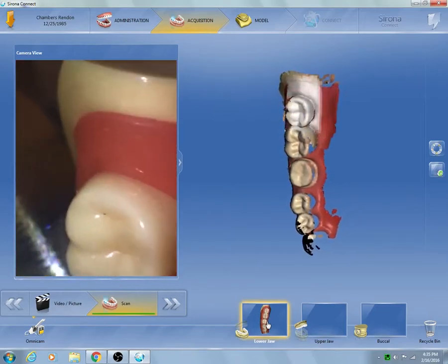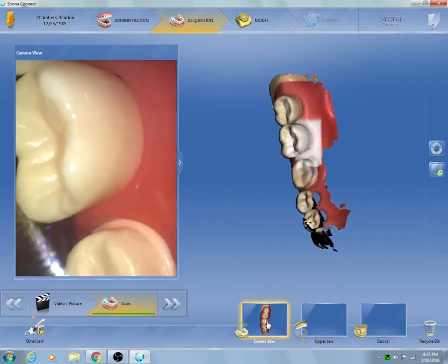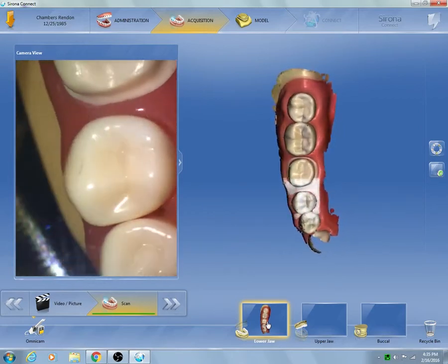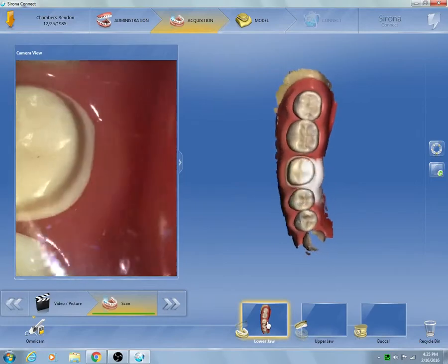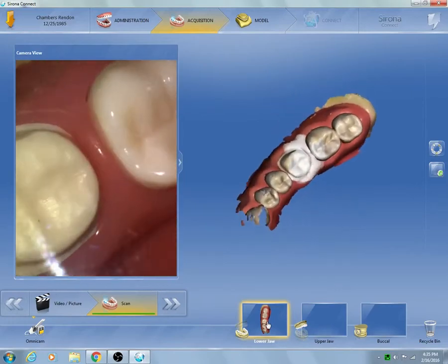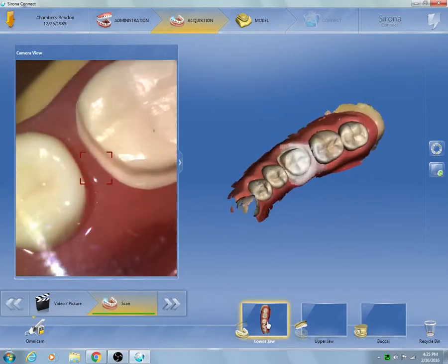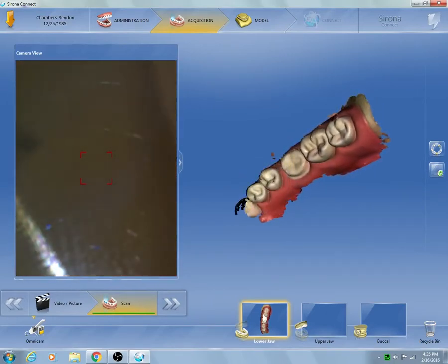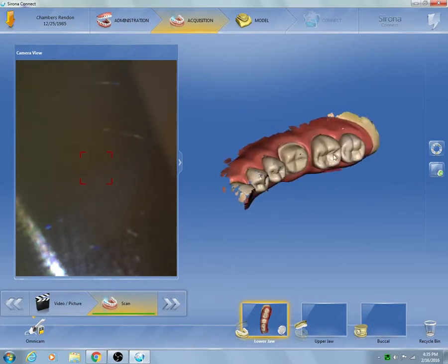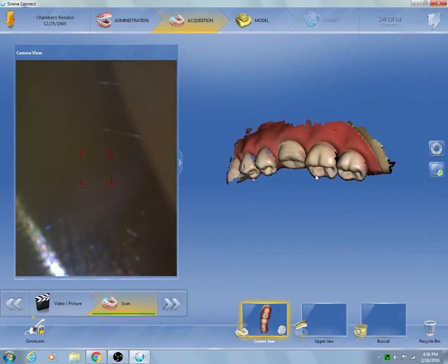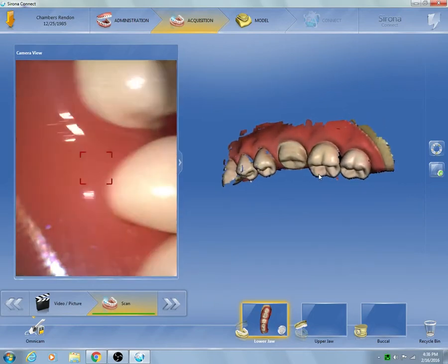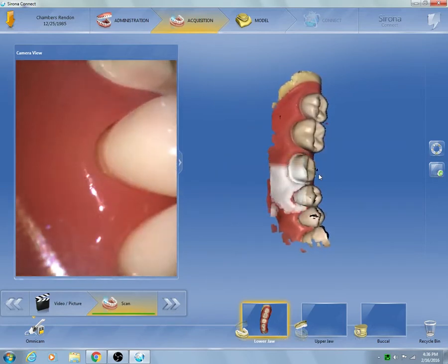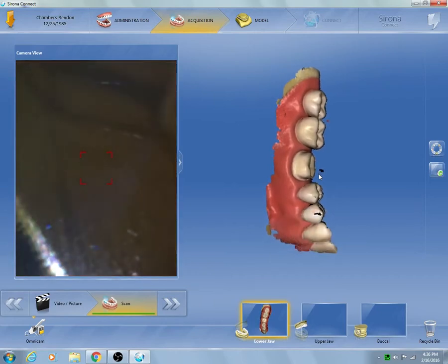Here I rotate it around to the lingual aspect and pull it mesially towards the front of the mouth. As I go back and forth I check to make sure that all blue areas have been accounted for. I go back again checking my interproximal contacts to make sure that we have a good fit. I rotate the model to see if I'm missing information. On the premolars I have a little bit of information missing, so I go back — the camera locks on to what it previously had and fills in the information automatically.